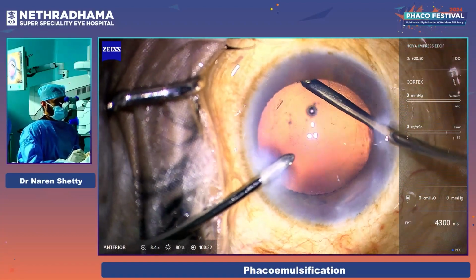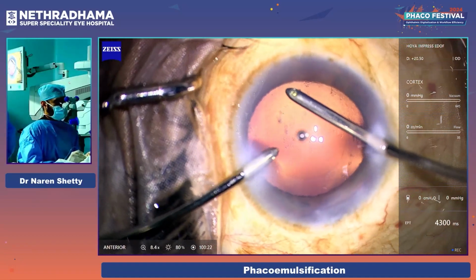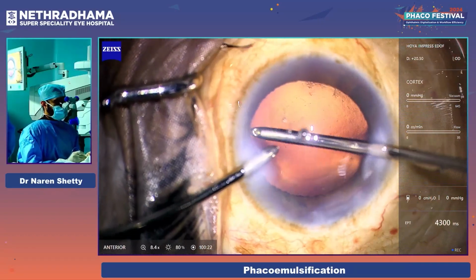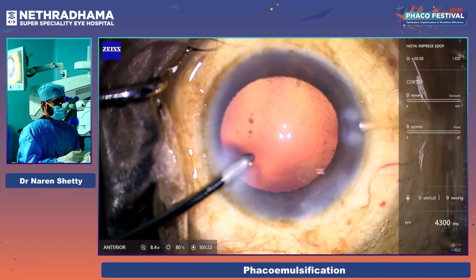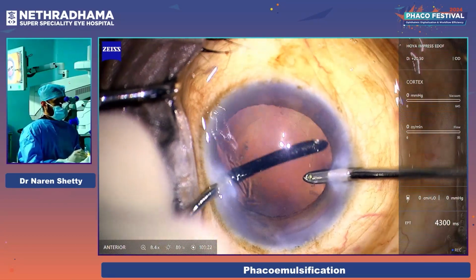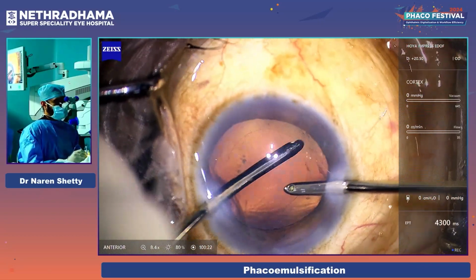It's important, if you hold the capsule like that, you instantly have to remove it, and then you can polish your anterior capsule. See? Usually it's a little more floppy once you remove the piece in these kinds of brown cataracts. So what you can do is polish a little bit of this.